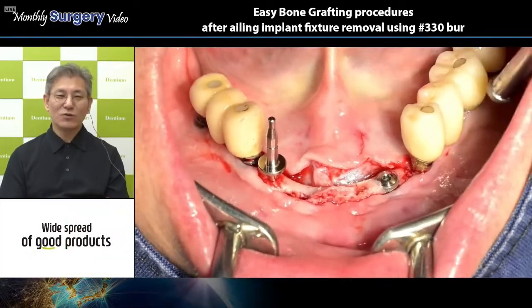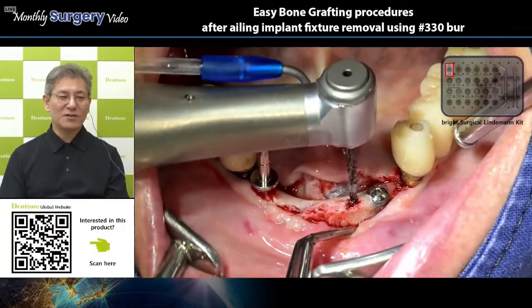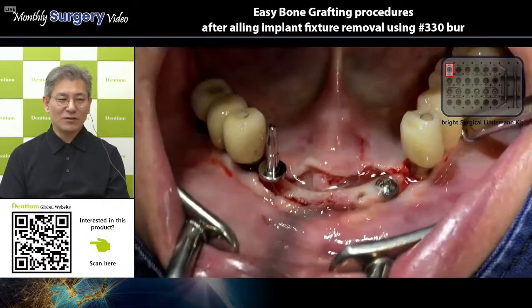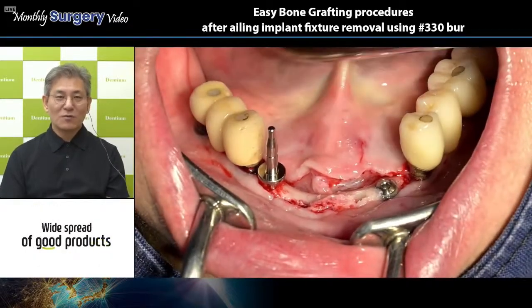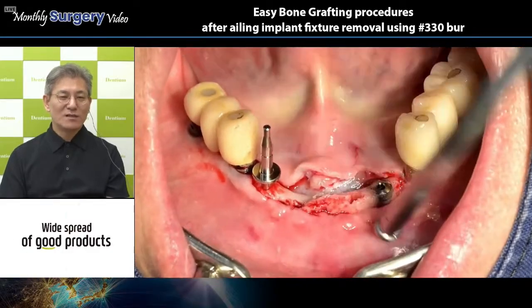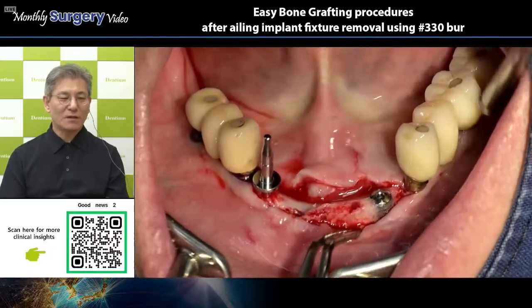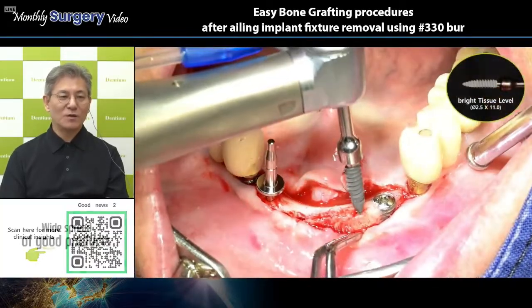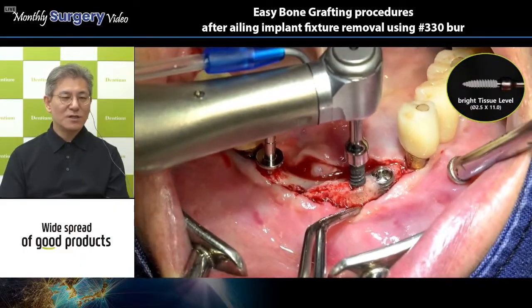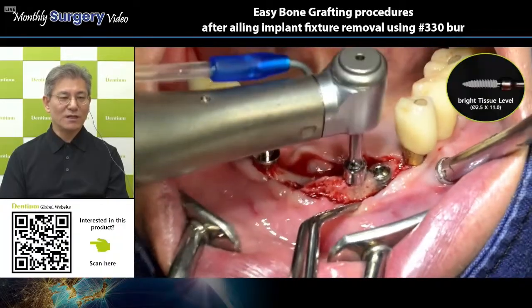So I think, due to the numerous experience with implant surgery, even though it is the freehand, manual type, the osteotomy case is very similar to using the surgical stent style. However, for a beginner or general dentist, sometimes using the surgical guide is helpful to make proper positioning on this narrow ridge.